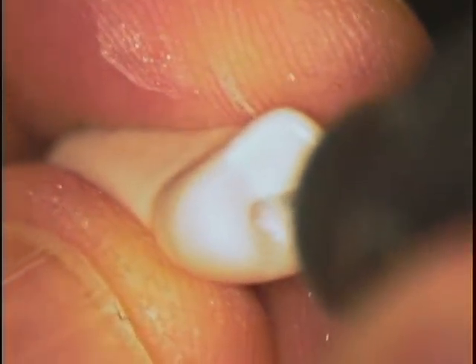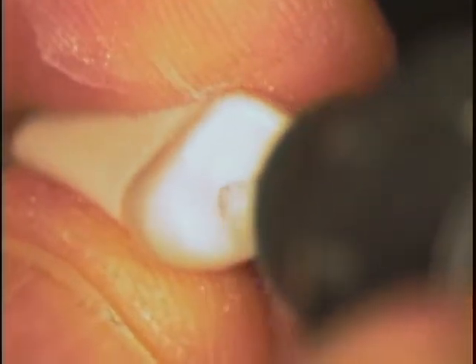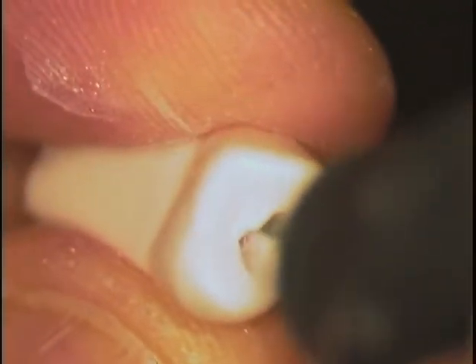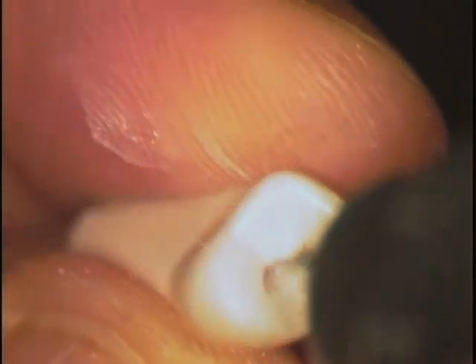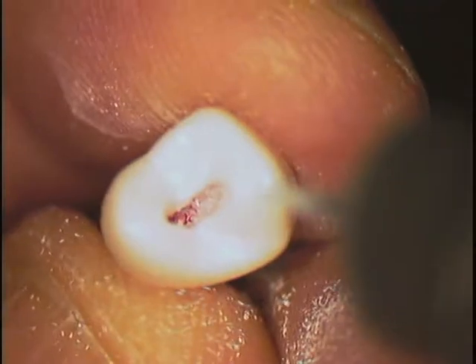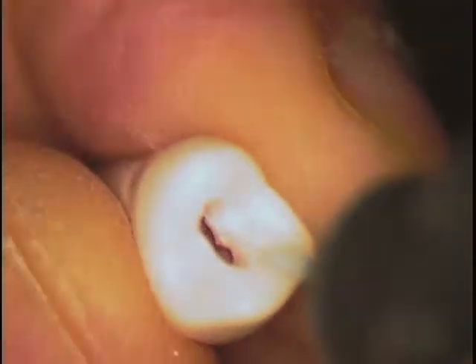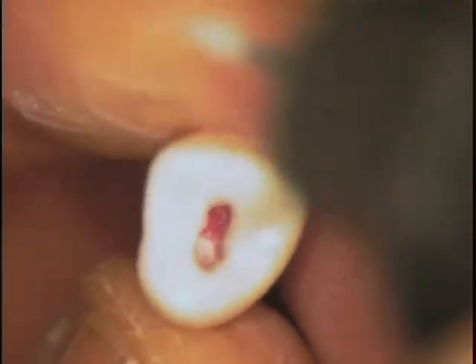So I'm starting with my oval shape, and I'm going low power again. Bring it in a little bit more. Let's take the roof off, all right? Okay, so I'm careful not to go too far in, because I don't want to cause any problems internally. So it's very quick to go in and create this oval shaped access hole. You don't want to be too conservative, yet you don't want it too big. So think about it, as you're creating the ovalness.